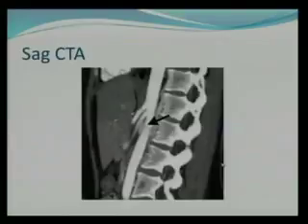This is a sagittal image in which I want to show you that this was a normal lateral view. Always look at the lateral view in every CT angiogram. You're looking at the abdominal aorta, the celiac axis and the superior mesenteric artery, which have a parallel finger-like orientation. And look here, between the superior mesenteric artery and the aorta, you see this compression, you see a sandwich, and this vessel over here is nothing but the left renal vein.